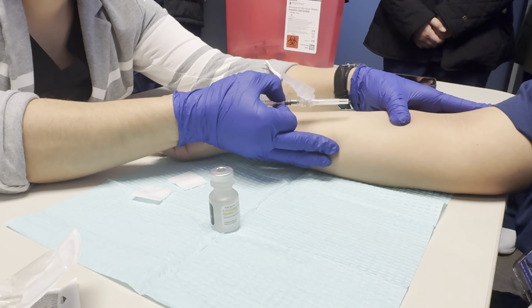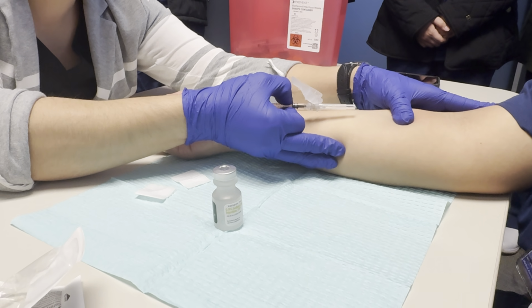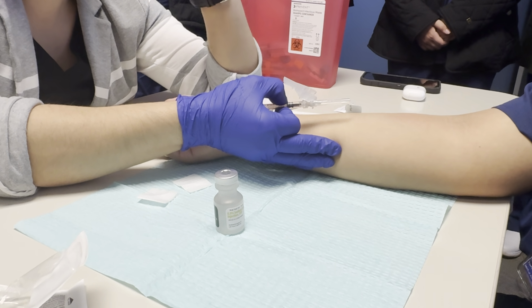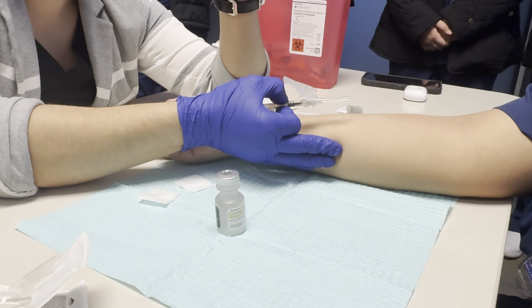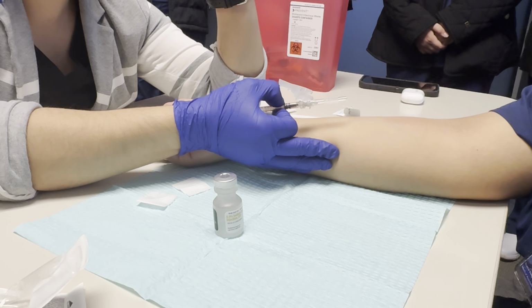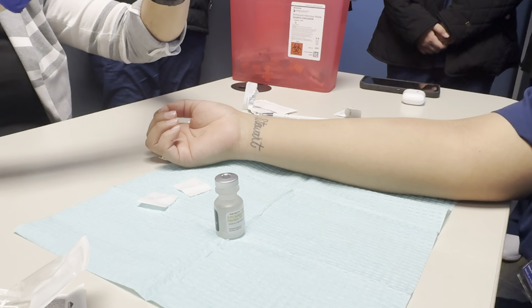My bevel is going to be up. I'm going to insert right under your skin, and then I'm going to inject my medication. Once I inject the medication, your skin is going to give me a wheel, like a bubble, and that's totally normal. Okay? Here we go.